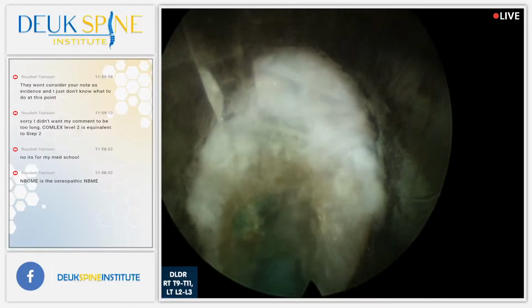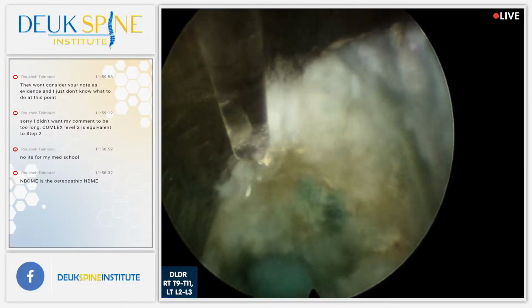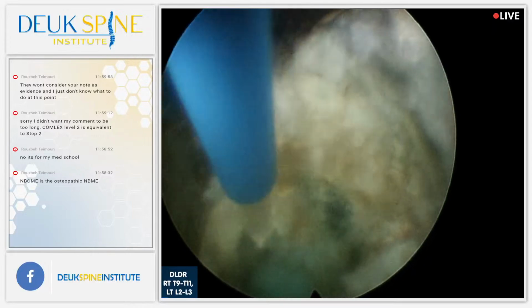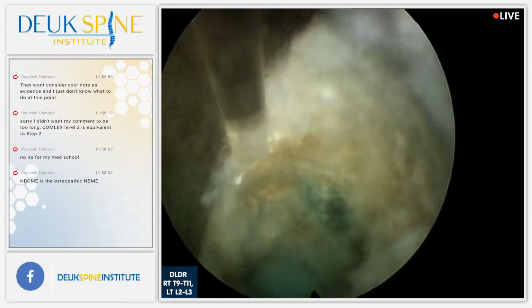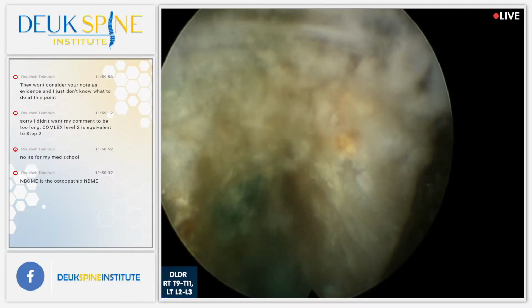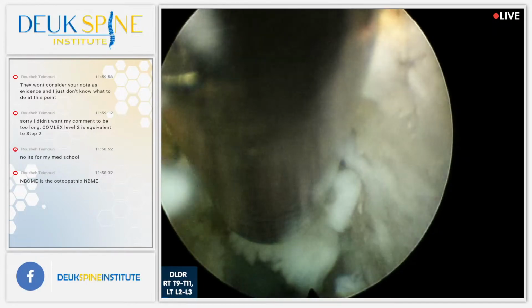Next question, if there is one. We're just about done here, by the way. You can see the end plate right there. You can see another end plate over here. Those are the bones on the sides of the disc. We've taken out a lot of herniation. You can see just a little bit of this annular tear is left. A little herniation right there. I'm going to go grab it right now. But we've removed a lot of herniation from this T10-T11. Is that right, Louis? 10-11? Yeah, 10-11.